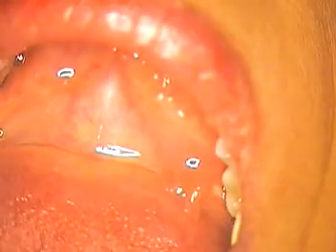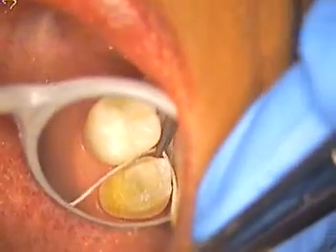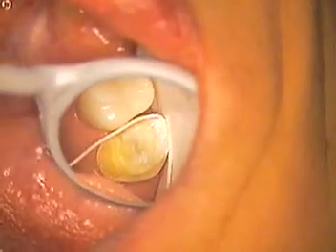Okay, we're back. This is Dr. Jerry Cuomo. I'm working on tooth number two. The rubber dam is off, and I'm going to go ahead and place a retraction cord. Now, this patient had some issues with Hemodent and Epicord, so we now use a plain cord on her. Plain cord, it has nothing in it, just a braided cord, number seven Siltrax.